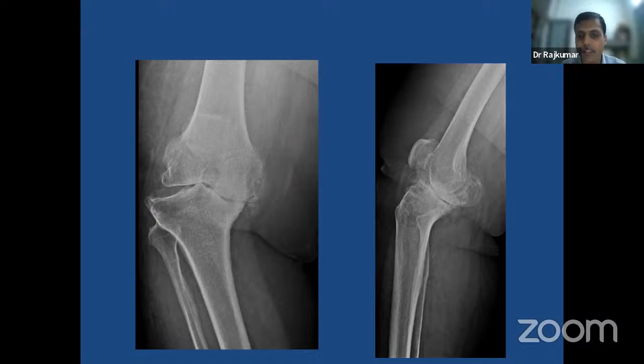The next important thing, coming to the lateral, it is really very unusual to have this kind of a slope, which is not very common. So you have to keep that in mind. Also, if you see, the proximal tibia is bent posteriorly in this plane. You have to be careful when you are placing your tray. In this case, you cannot prepare the tray keeping it in the center. You have to anteriorize the tray, bring the tray a little anterior. So your entry point has to be very careful.